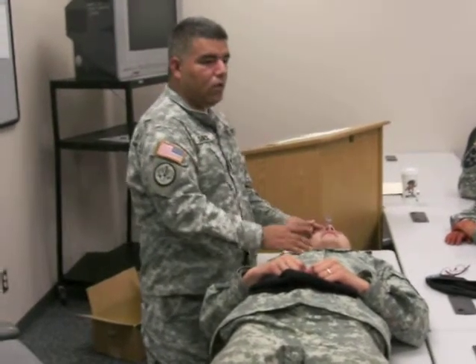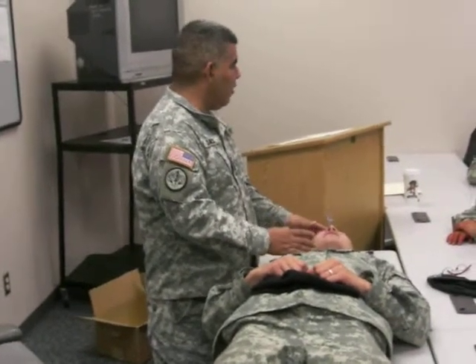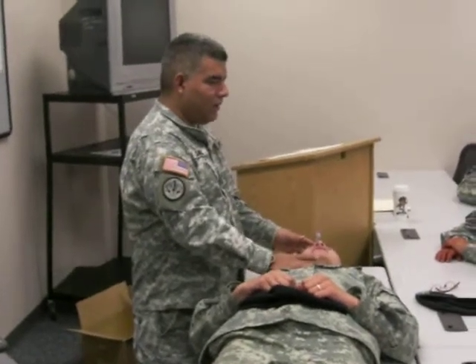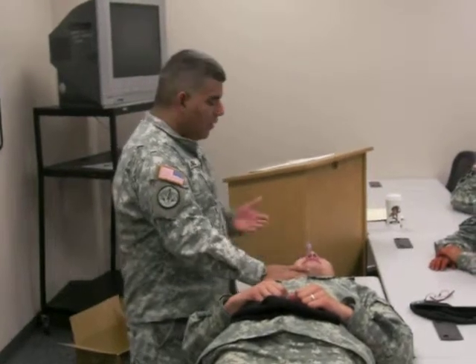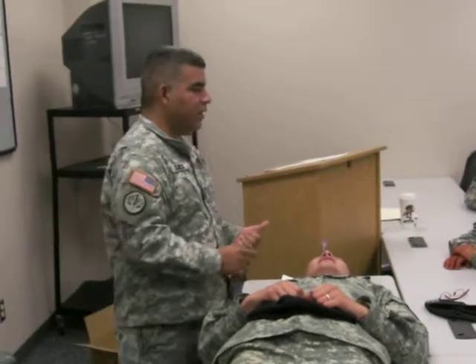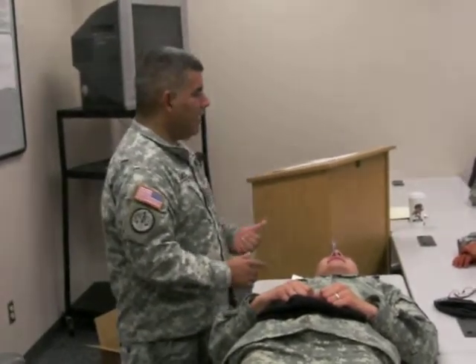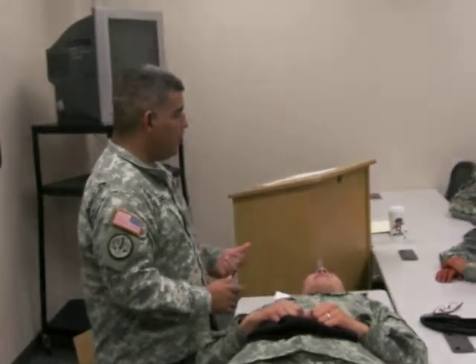Now, in an actual real-world casualty, the pain is secondary, okay? We need to get that airway open. So you would actually go ahead and do it on the other side. But since he's here with us and he's got some tears in his eyes, we're not going to go ahead and do that, okay? Again, the reason for this is because we have an airway compromise and we need to get this airway in, okay? And like I said, in an actual casualty, this does go in quick, and I wouldn't care whether it's hurting or not, okay? It's got to go in, we've got to put it in.